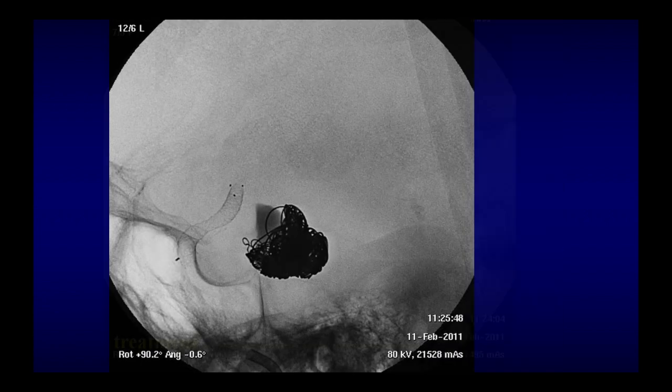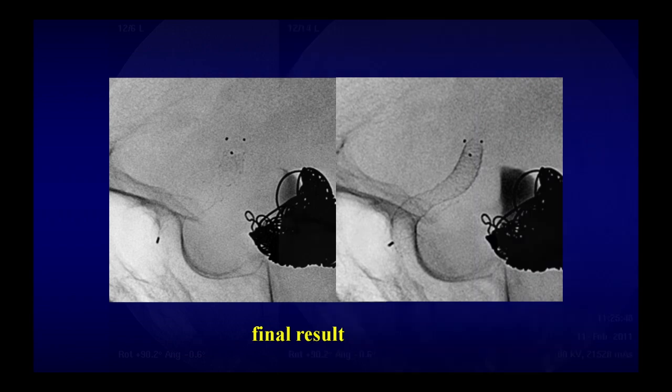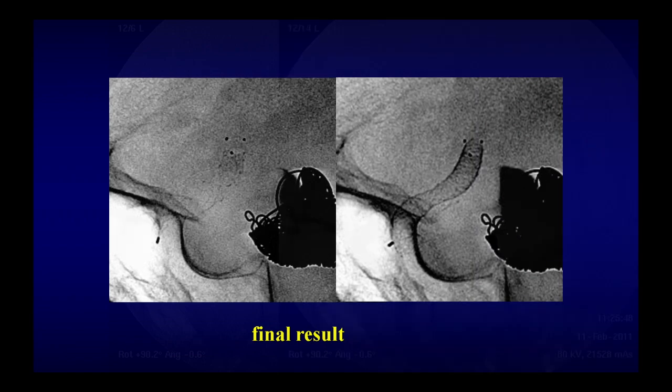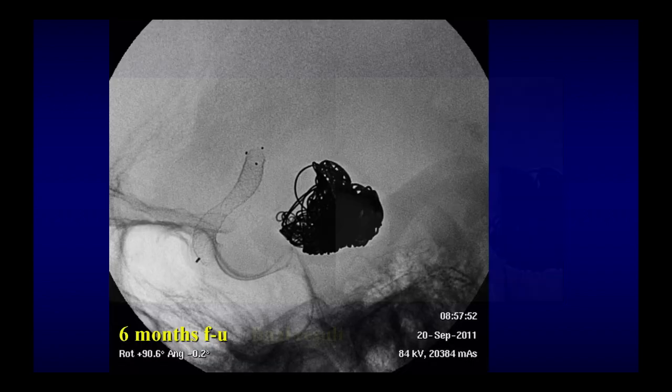It looks not bad, but if you look carefully, I hope I can, well, this is the flow diverter, but this is a solitaire. And you see that the flow diverter is here and the wall of the artery is there. I made it stronger, you see the difference. So the flow diverter is not really on the wall of the artery.